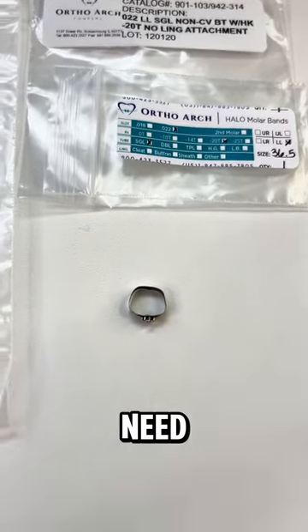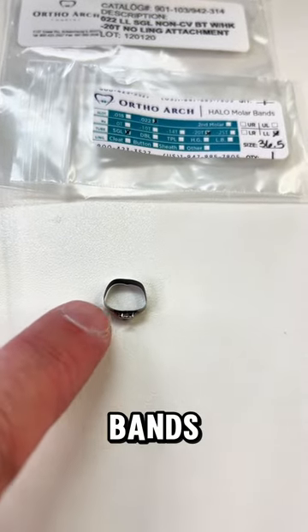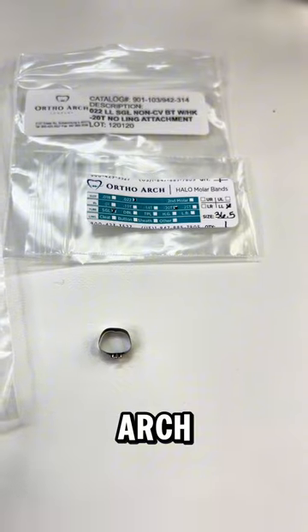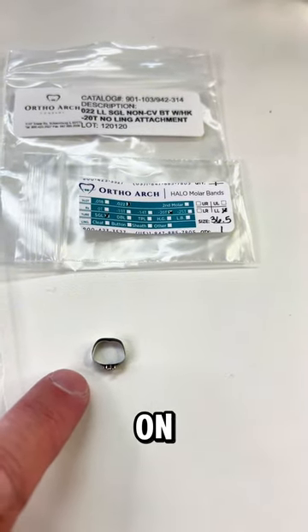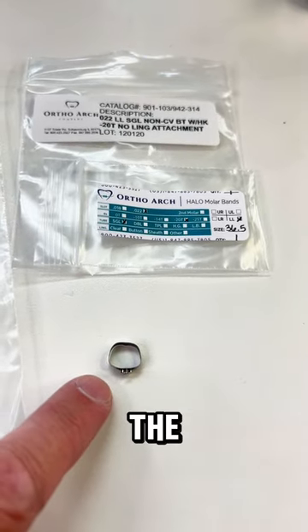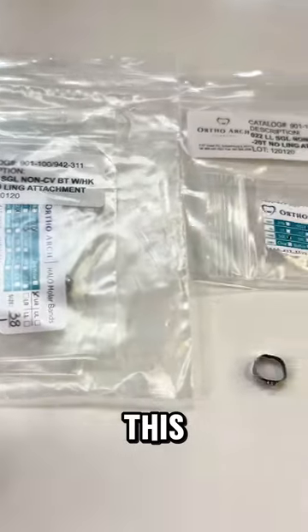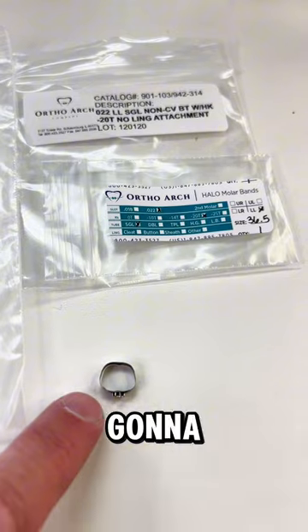You're going to need bands for the typodont — make sure the bands fit your typodont. If you order the typodont from OrthoArch, they will give you bands that correspond to those typodont sizes. Get molar bands for all of the first molars, both upper and lower arch. They come in little baggies and you should have four bands total for all of the first molars.